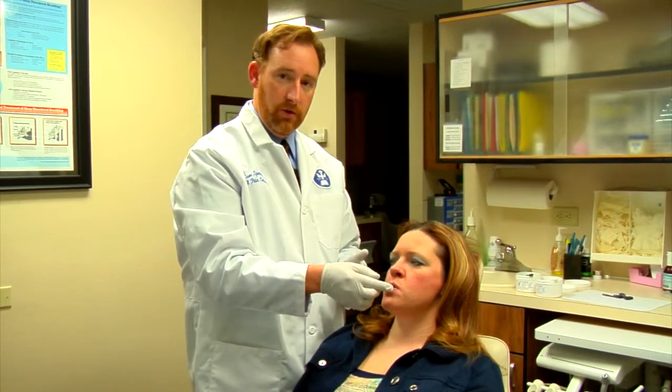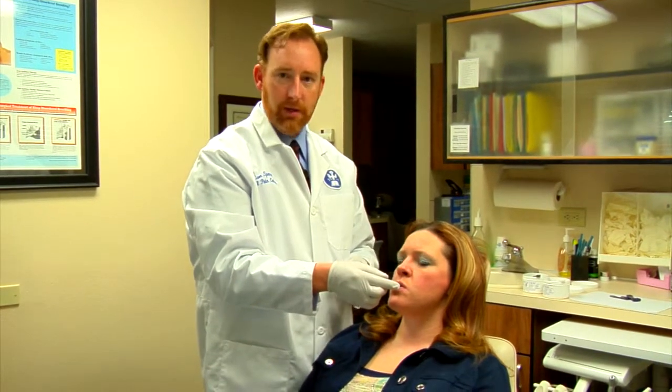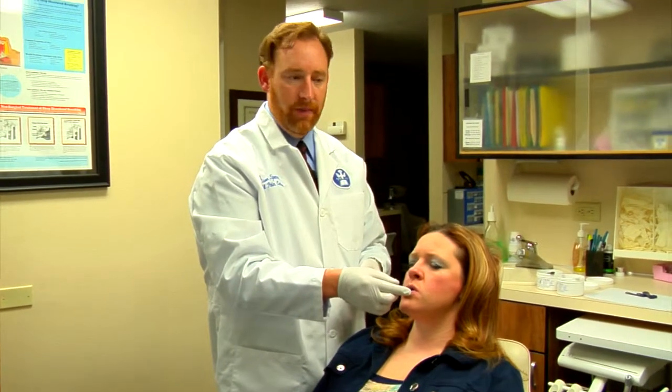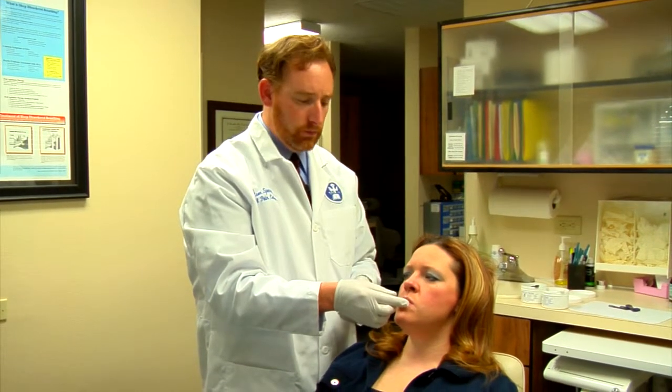Since this does not enter the oropharyngeal space at all, the palatal area, there's no inducing a gag reflex or any problems like that. So with post-anesthesia nausea and things like that, this is not a type of appliance that will induce emesis or even make the patient feel gaggy.